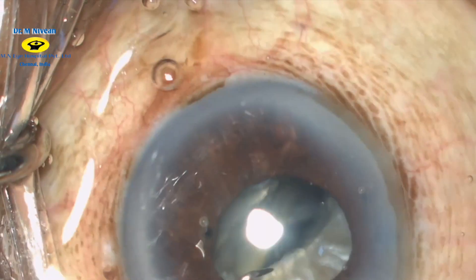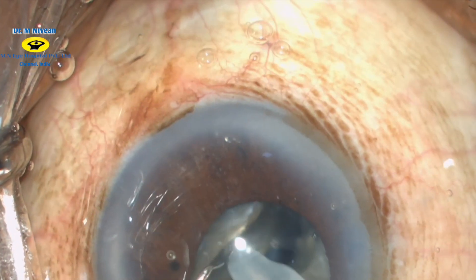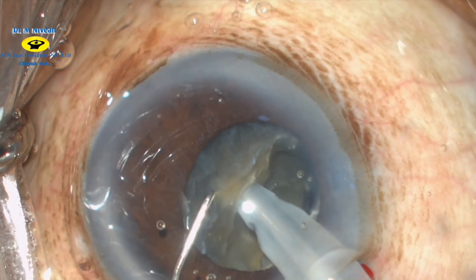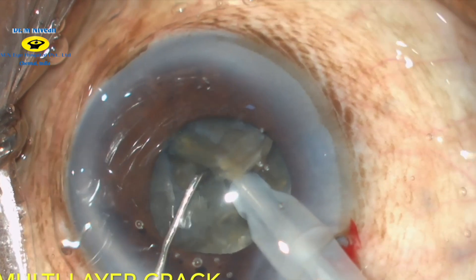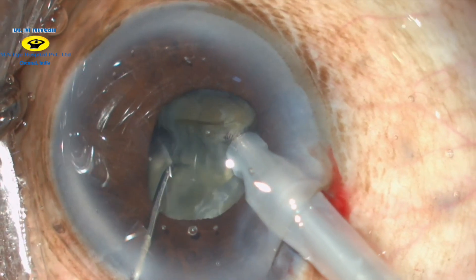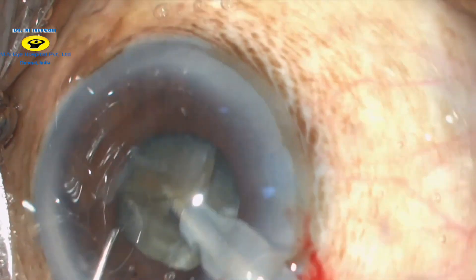Again in phaco 2 mode, the probe is buried into the core of the nucleus, slightly lifted up, and the chop is then initiated. In these types of leathery brown cataracts, multi-layered cracks are required. So go deep and make sure that the fragments are separate.